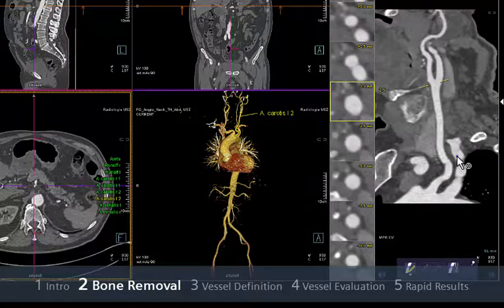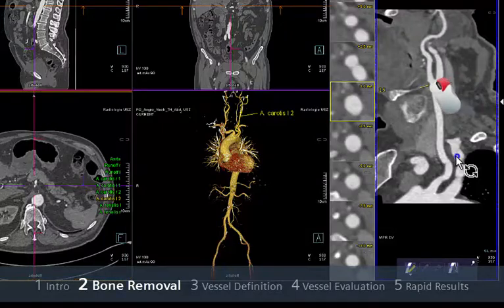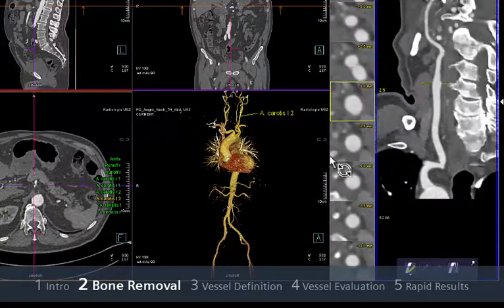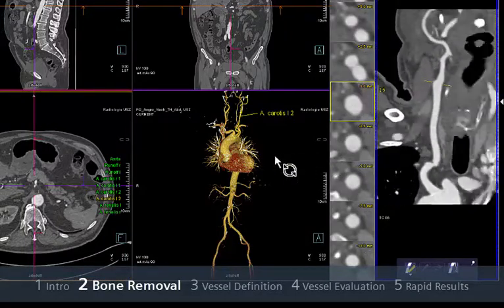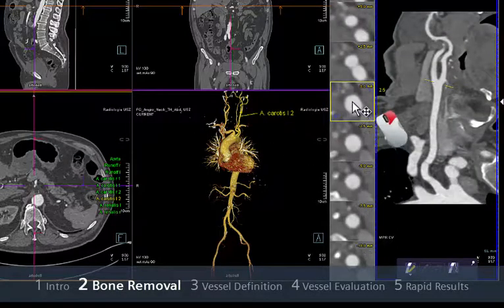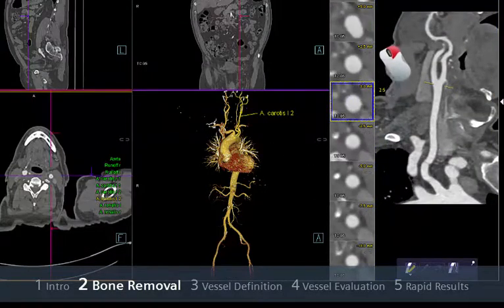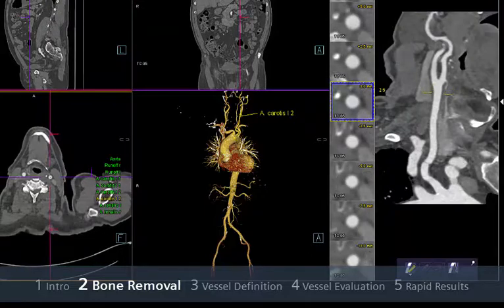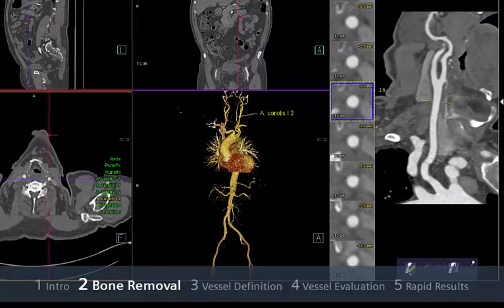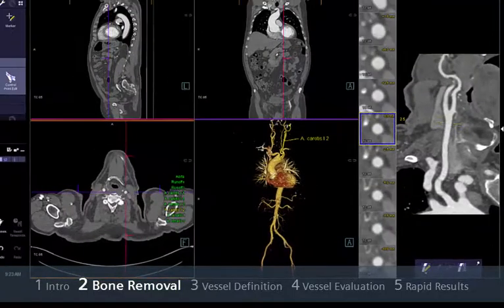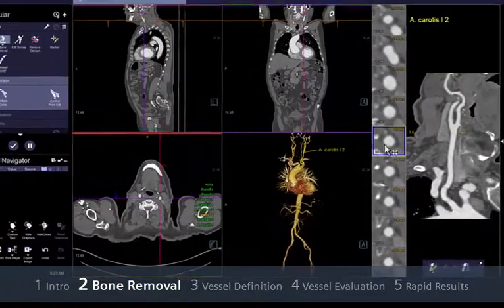Navigation is really simple. Just press the right mouse button and drag the mouse horizontally over the CPR to rotate around the axis, or drag it horizontally over the cross-sectional segment which is framed with a yellow border. Make sure that a yellow reference moves over the vessels indicating the position of the frame segment.